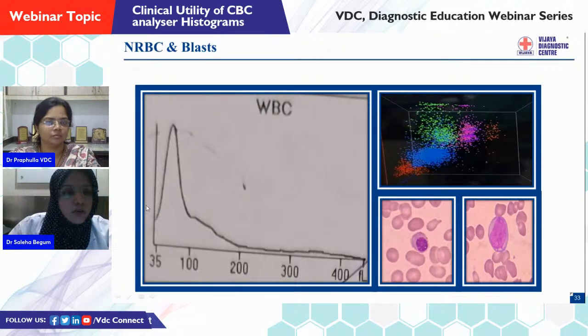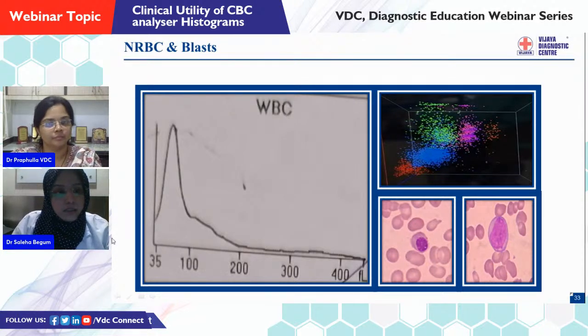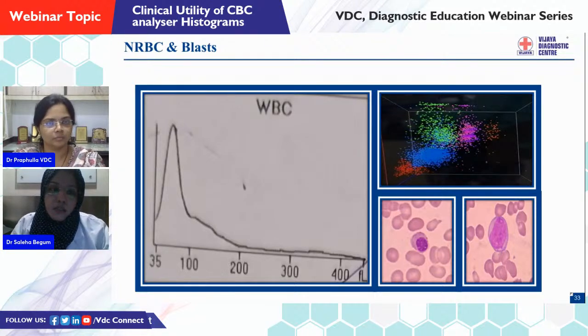This is another graph showing only one curve, not starting at the baseline and having a broad descent and not showing a large cell population. So upon examining the smear of such a case, we have found out that there are NRBCs present in the patient blood, there are blasts present in the patient blood. So the graph not starting at the baseline indicates that there is some population which is smaller than a lymphocyte. So here in this case it is an NRBC which is not letting the graph start at the baseline. Okay, so NRBCs are there, the graph is not starting at the baseline, and the graph is showing a small bulge at the end of the lymphocyte population, that is nothing but corresponding to the blast window.